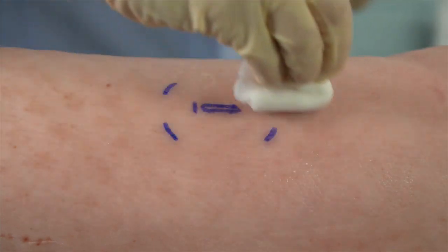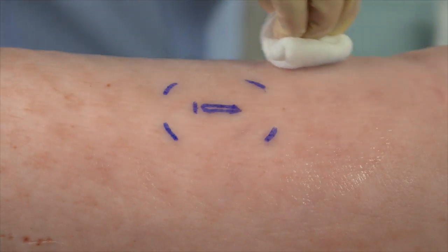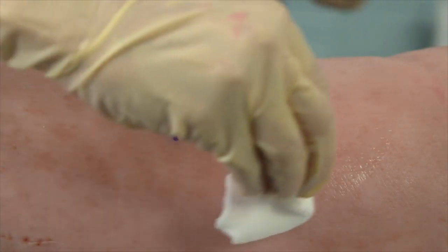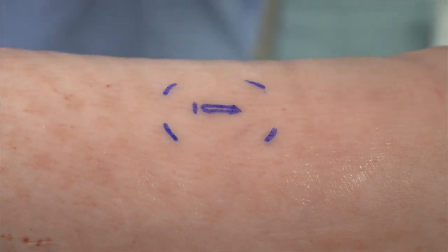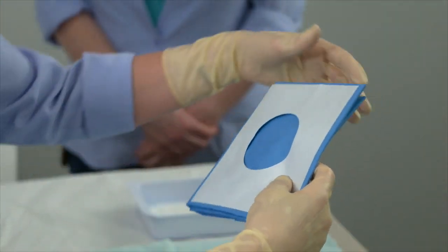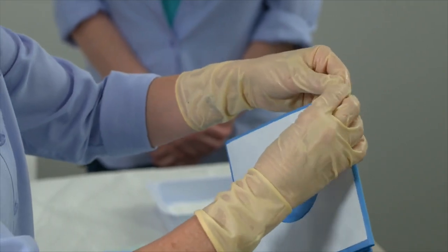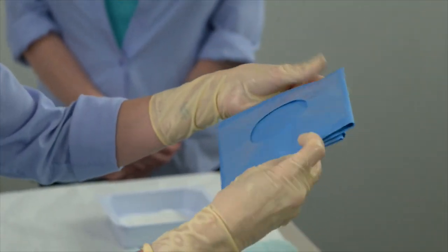Using a circular motion and moving outwardly, disinfect an area larger than the adhesive around the drape's aperture. Allow the disinfectant to dry for 30 seconds. Repeat for a total of 3 passes using a new swab or gauze each time. With the aperture of the second drape still folded, remove its adhesive backing and fold it in half.